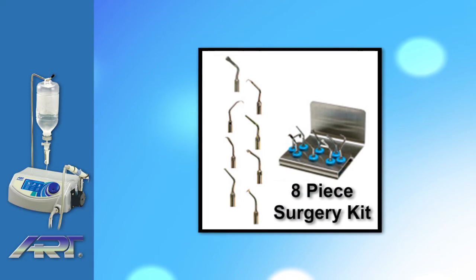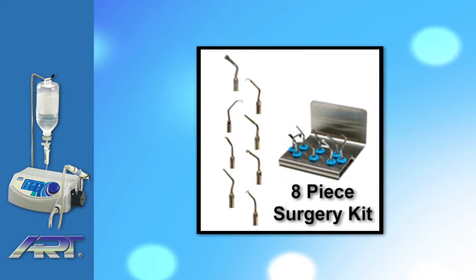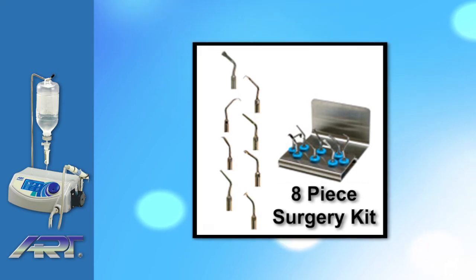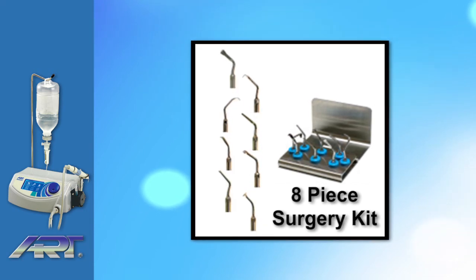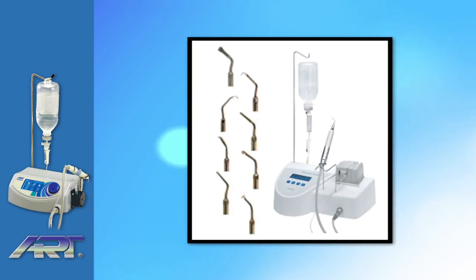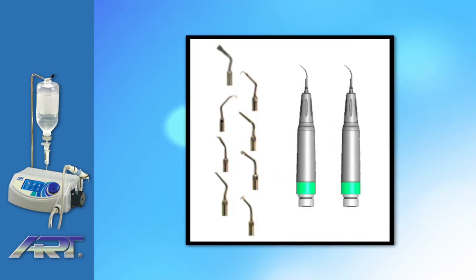The Ardiotomy Piezoart OP1 comes with an eight-piece basic bone surgery kit, and any additional or special tips are available upon request. Tips are made to be compatible with major brands like Metron's Piezo surgery system among a few others. The kit also comes with two autoclavable handpieces.